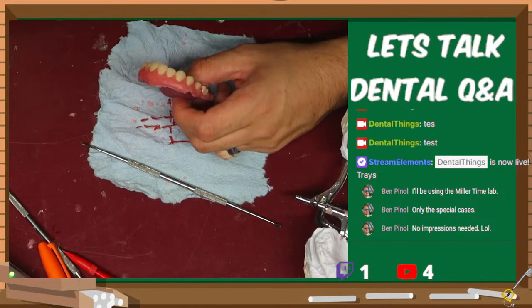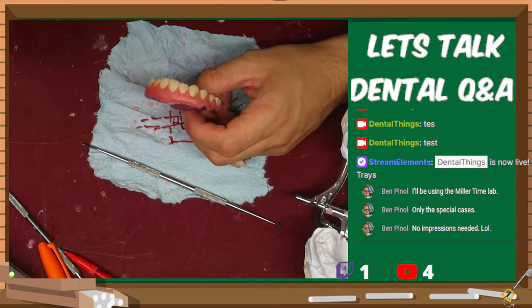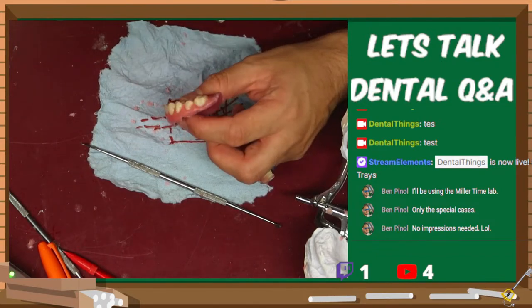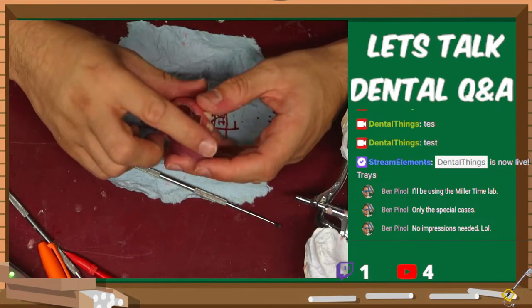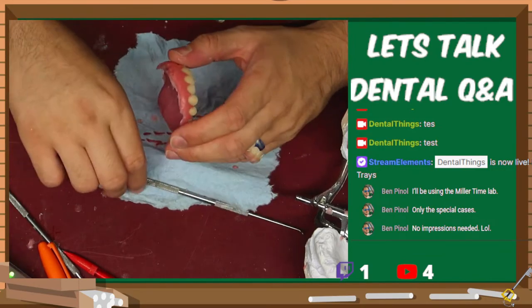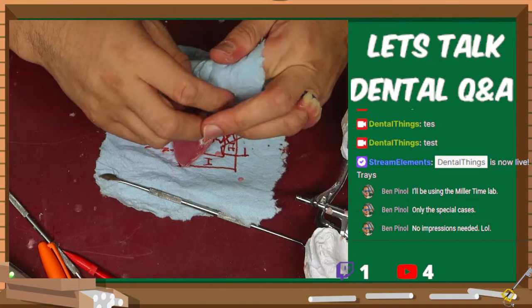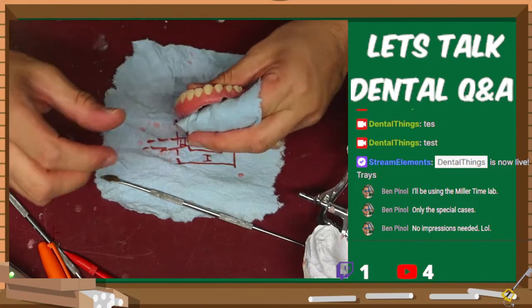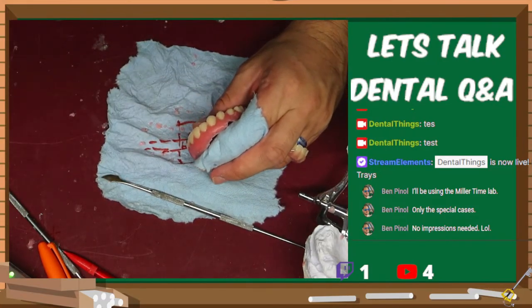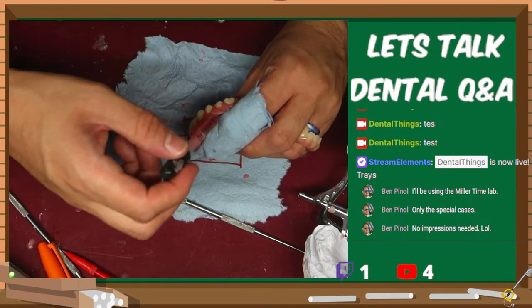But I need to record it. I actually need to make a video doing that, but that will come one of these times. I do want to add a little bit of wax to the edges right here, like I was mentioning. So it's burning time for my fingers. So let's go ahead and wrap my little cast around as I go and dabble with some of this hot wax.